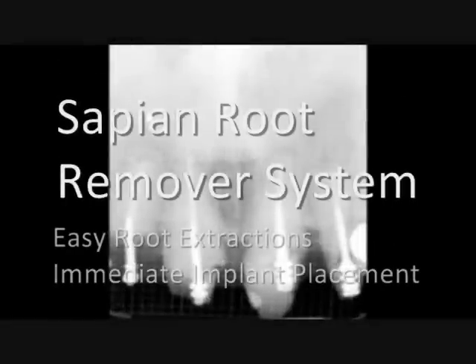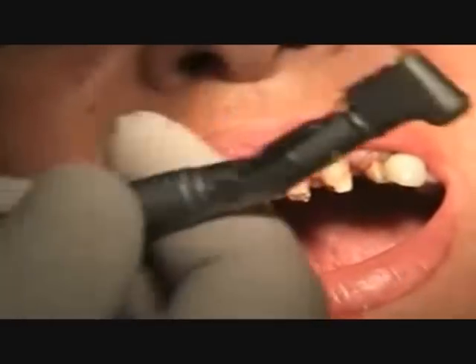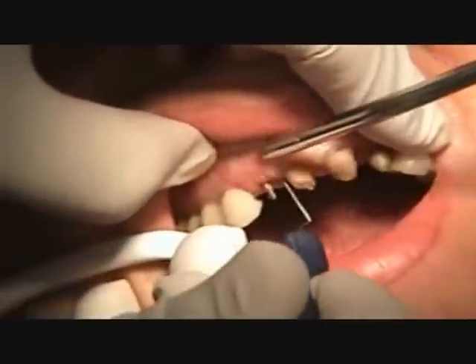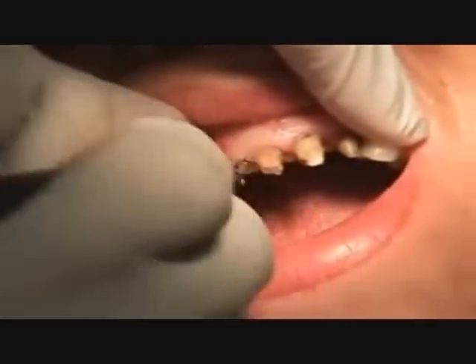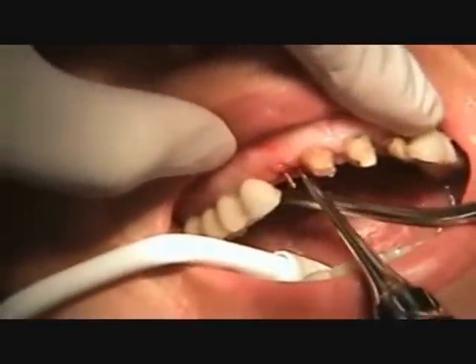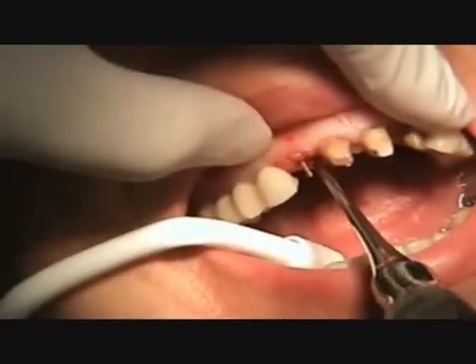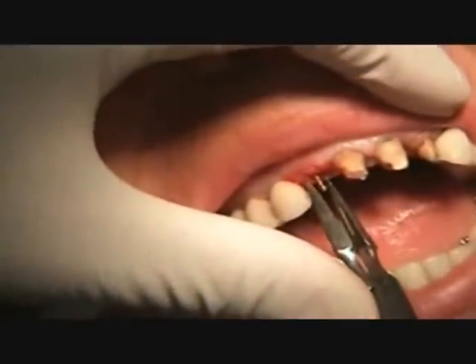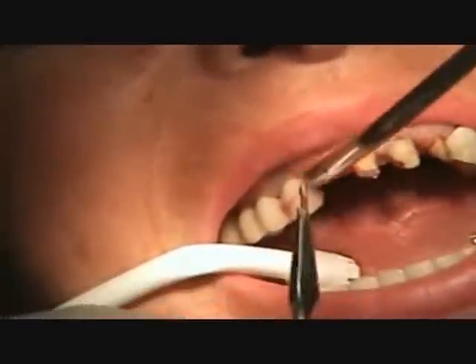Here's the preop broken right lateral incisor — it can't be removed with forceps under normal conditions. First, we're going to utilize a periotome to break the periodontal ligament connection. Here it's going in on the proximal aspect. We're going to rotate it and use pressure to drive it into place. After that, we're going to use a simple luxator and luxate the root canal just slightly to begin making it mobile. We also have to remove the pin inside the root canal using a pin remover and rotating it out.